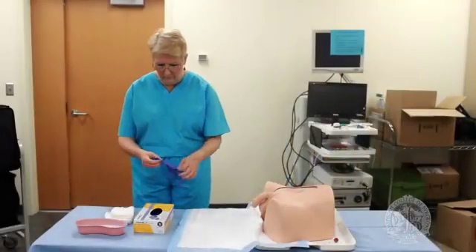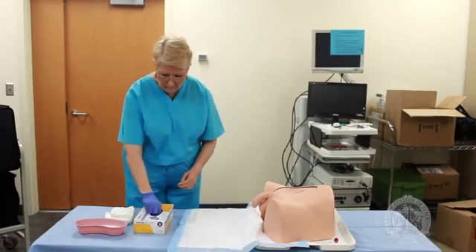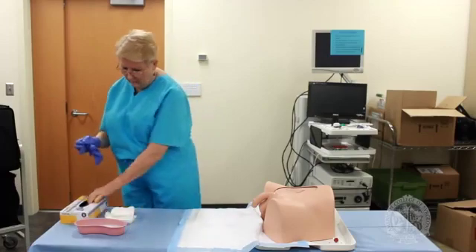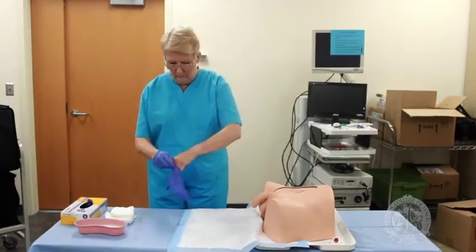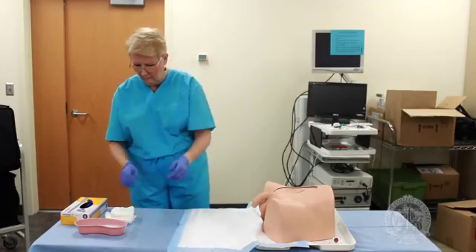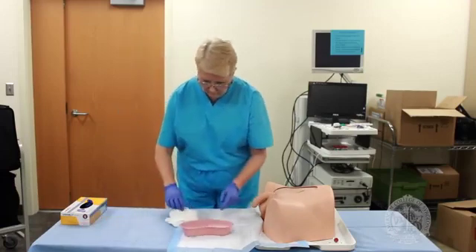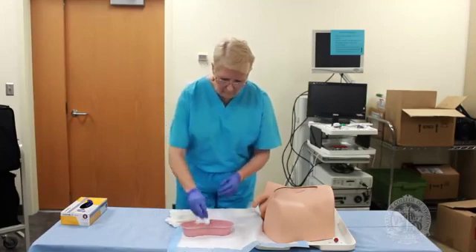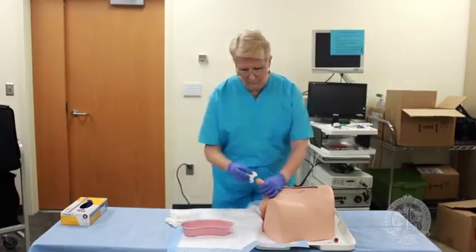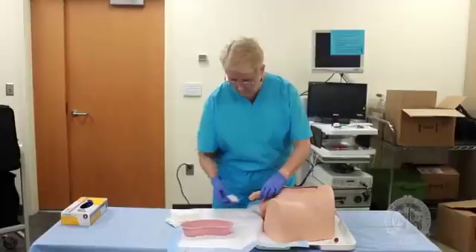In this video, we will be focusing on placement in a patient with a penis. Positioning is key for this procedure. Place the patient in the supine position with their legs extended. Place a waterproof or absorbent pad under their buttocks and upper legs. Ensure privacy for the patient — pull the curtain and expose only the necessary parts of the body. Sanitize your hands and put on non-sterile gloves. This first part is not sterile. Cleanse the penis with towelettes or with soap and water, making sure to retract the foreskin if present.